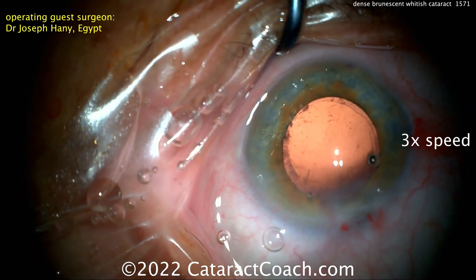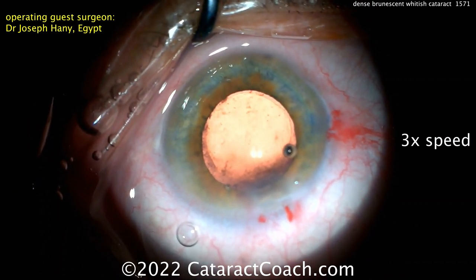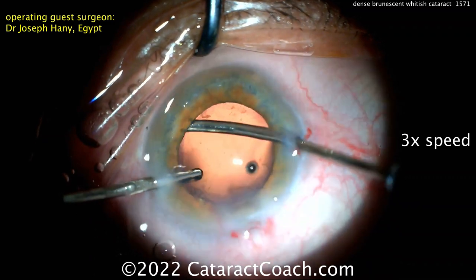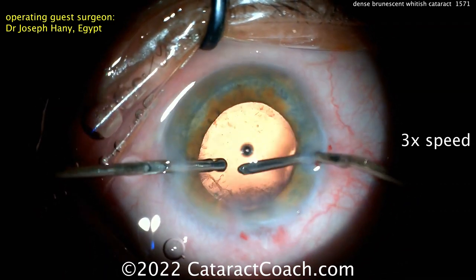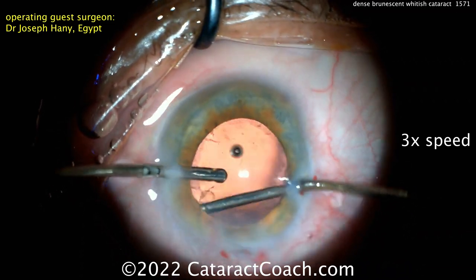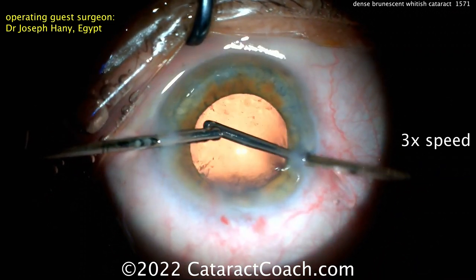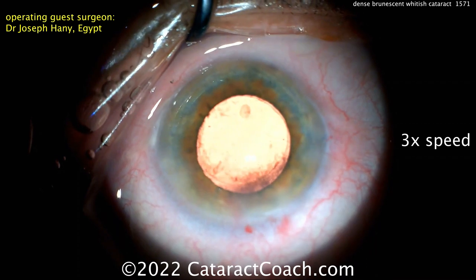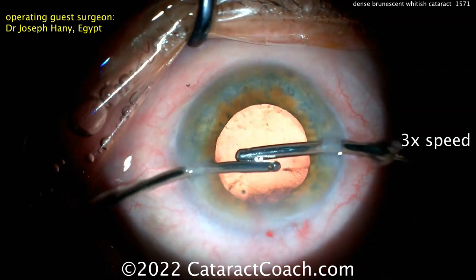Centering up the microscope and cleaning up some cortex — really not a whole lot remaining. There's something really satisfying about doing cataract surgery like this on someone with such a severe cataract, where the preoperative visual acuity is probably hand motion. This is an amazing procedure — you can give the patient fantastic, normal vision in a surgery that takes just a few minutes. It really is a modern miracle of medicine. Clean it up thoroughly, but don't go overboard polishing the capsular bag — you want to ensure a beautiful result on post-op day one with minimal risk.